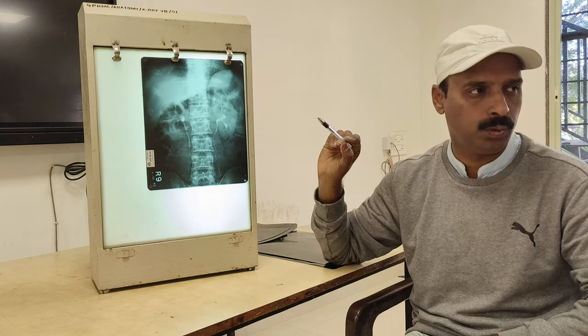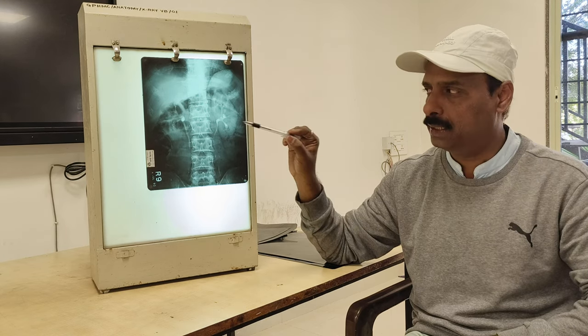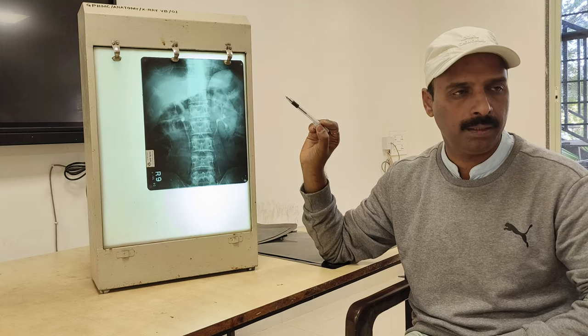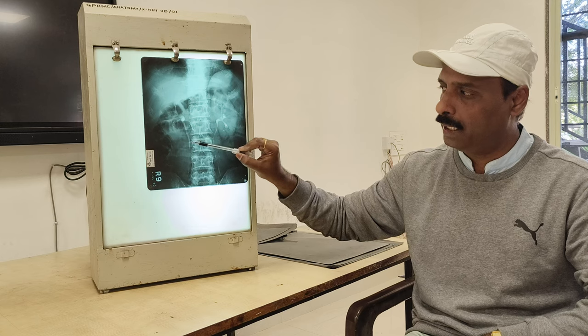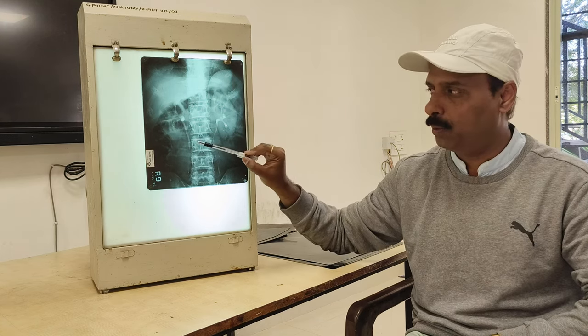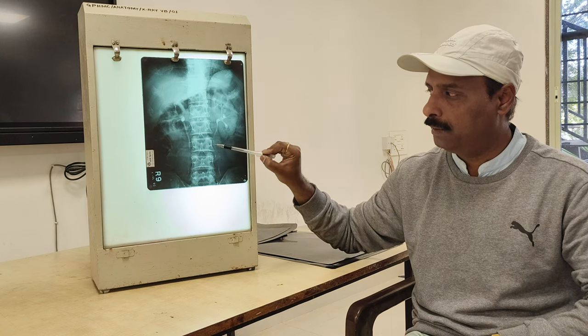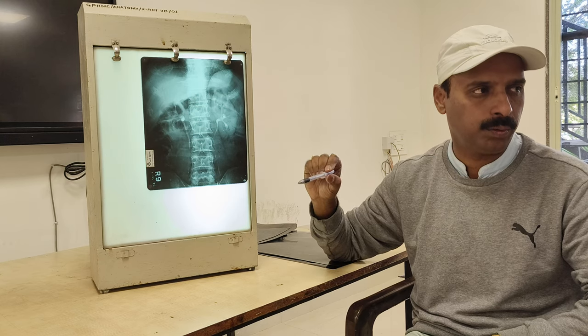On both sides, both the kidneys show the right and left kidney stones. Renal lithiasis we call it, renal lithiasis or kidney stone or renal stone. If these shadows are seen in the ureter, then it is a ureteric stone. If they are found in the bladder, then it is a bladder stone.